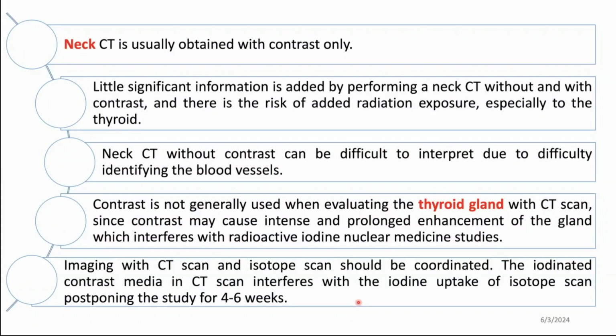We either do the nuclear medicine scan first and then the CT scan, or if the patient has a CT done with IV contrast, the thyroid gland will take up some of the IV contrast and this will interfere with the uptake of the radioisotope when it comes time for the nuclear medicine scan. So the patient has to wait up to 6 weeks after the CT with intravenous contrast before doing a thyroid scan. Otherwise, the scan will be suboptimal. All right.